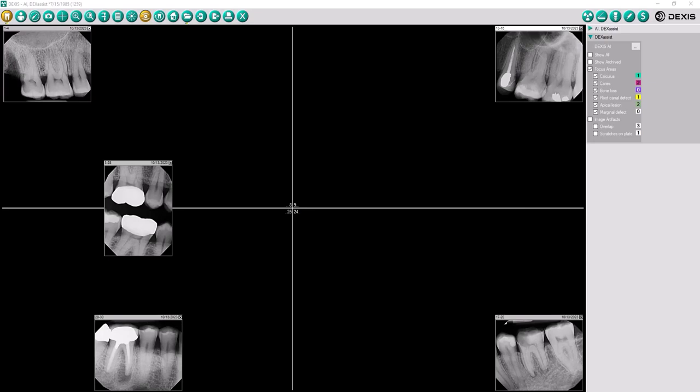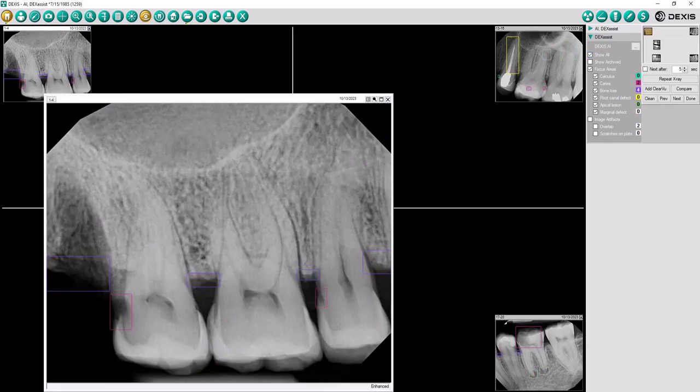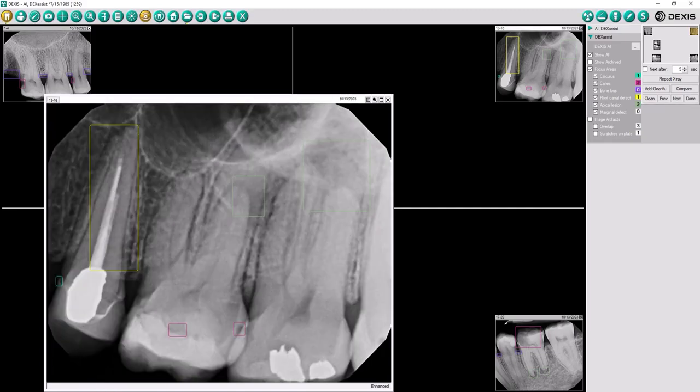Welcome to the DexAssist solution with 2D findings powered by Assisted Intelligence. The DexAssist solution incorporates AI features from DTX Studio Clinic into DexAssist Imaging Suite software.